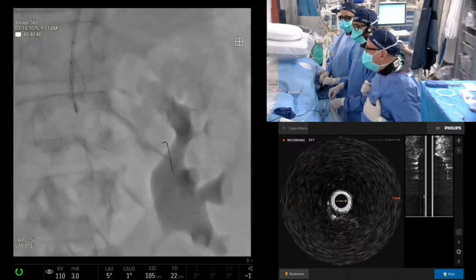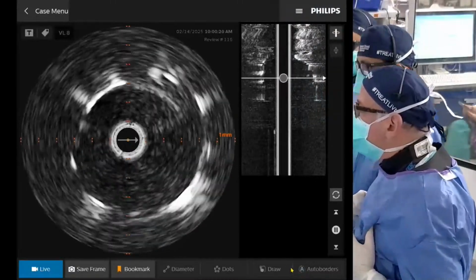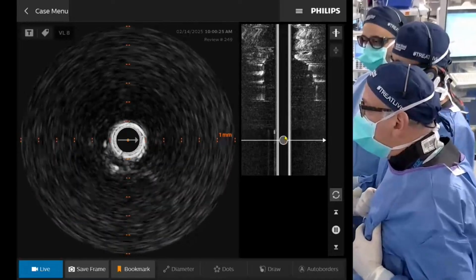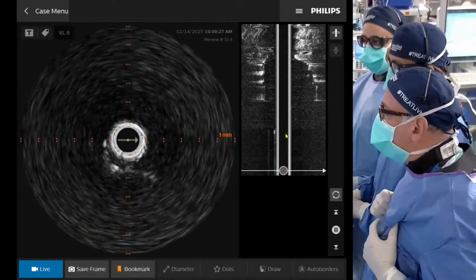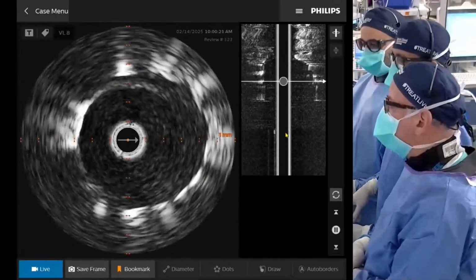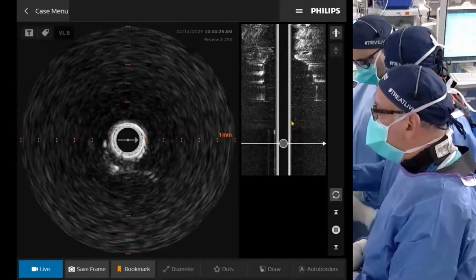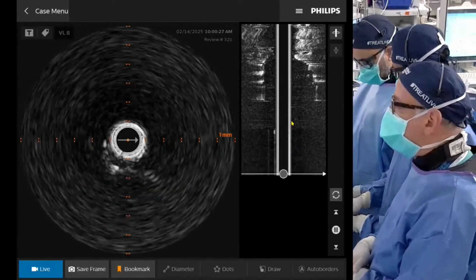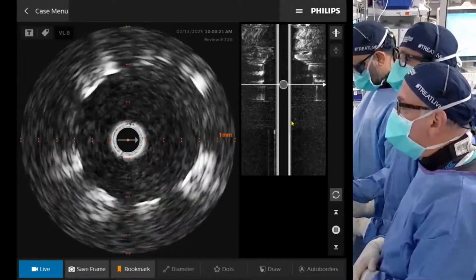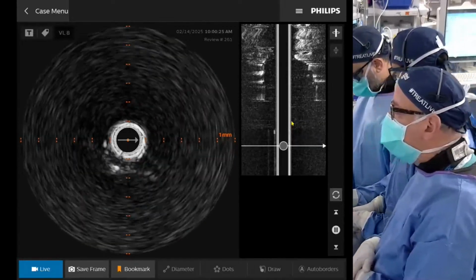good on the ostium. I'm probably inclined to leave this alone for now instead of extending it distally. There's possibly some stuff going on distal to the edge of the stent. I'd prefer to see if the immunomodulators can help stabilize that instead of going after it and just putting more metal inside. But I think this is a good place to leave this patient. And again, I think we did a very, very aggressive, global revascularization here.